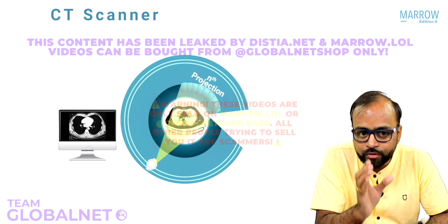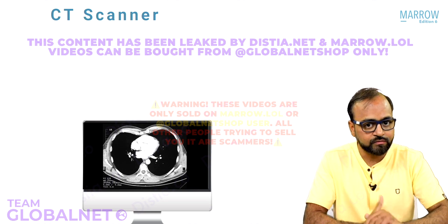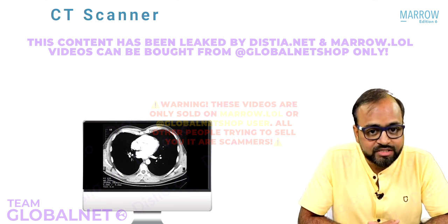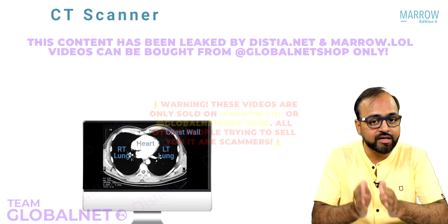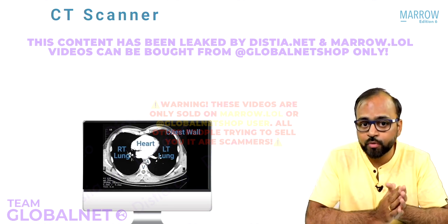Now, if you look carefully at this particular image, suppose that we are trying to scan the chest part of the patient's body. What can you see in this image? Can you see that in this CT scan chest image, I can actually see the chest wall, I can see the right lung, I can see the left lung, I can see the cardiac anatomy, I can see the aorta, posteriorly I can see the vertebral bodies, right?